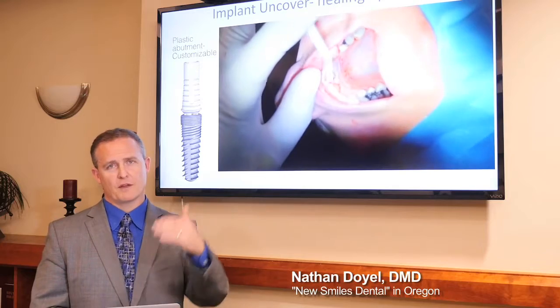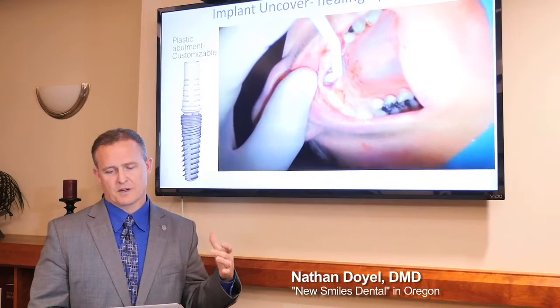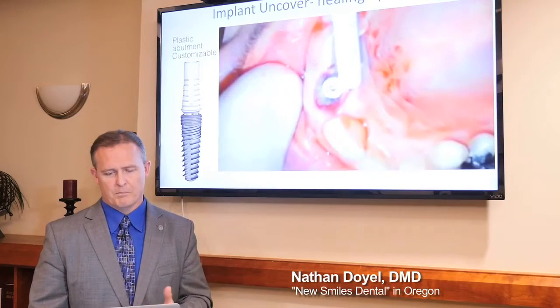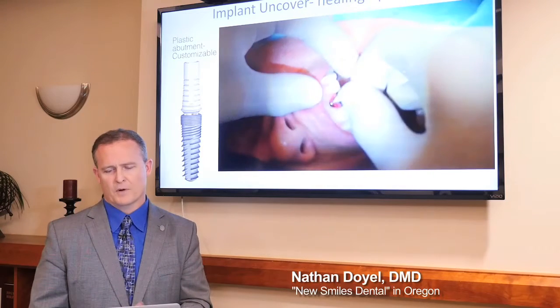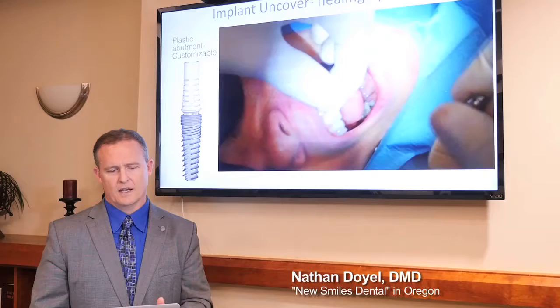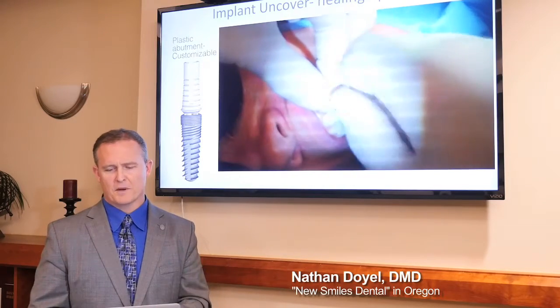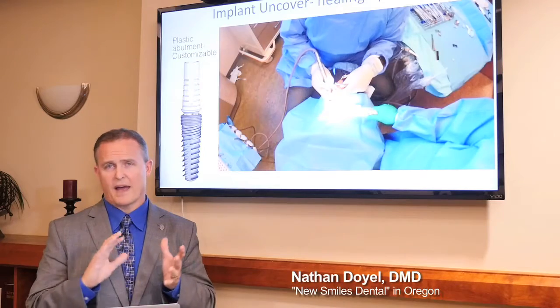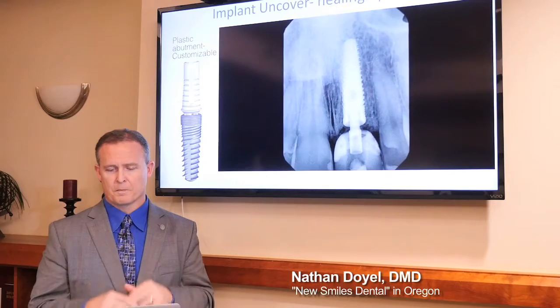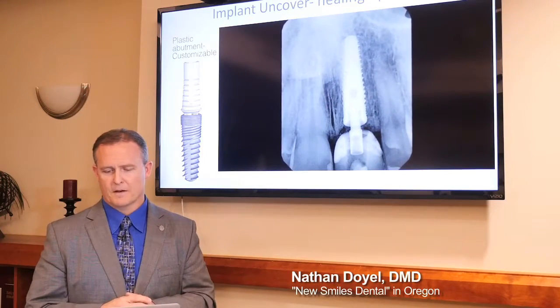Little gap between where the implant is and the edge of the buccal bone. I'll pack that in. I also think it helps stabilize the implant as well. But right here, I used a customizable plastic abutment, put it in place, did a suck-down on there, then picked the whole thing up, and I just added a composite around the margin, and this is what it looks like on an X-ray.